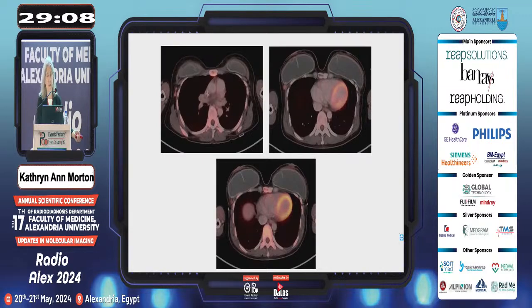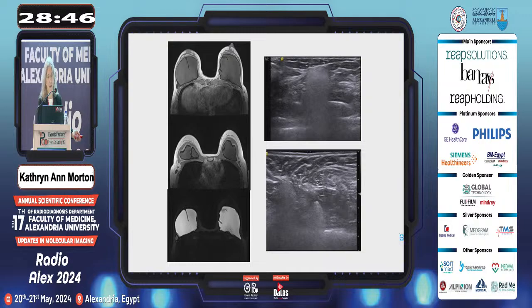You've seen cases like this also shown by Ahmed and Dr. Covington, but this is a patient with bilateral breast prosthesis. There's increased uptake in several lymph nodes, and the suggestion was, well, is this a lymphoma, recurrent breast cancer, or what? But there are two ways of dealing with this with other imaging.